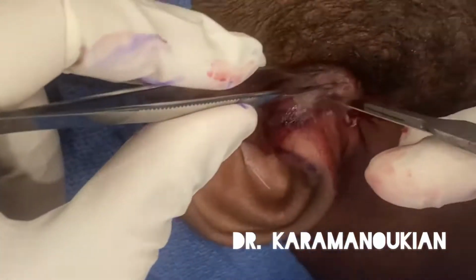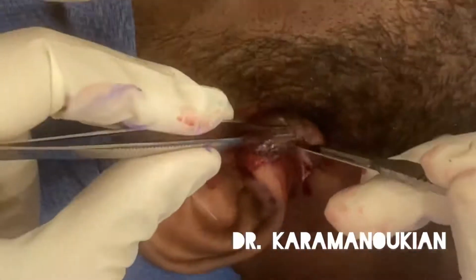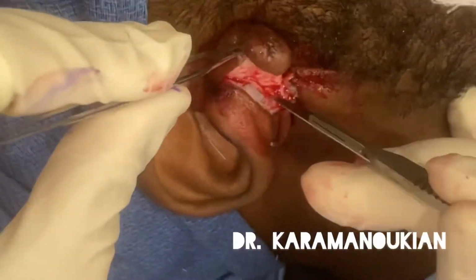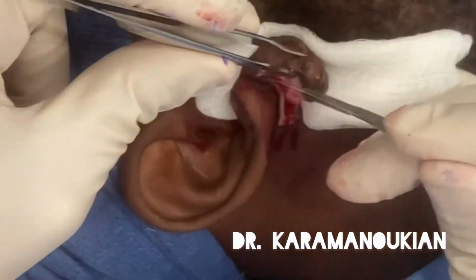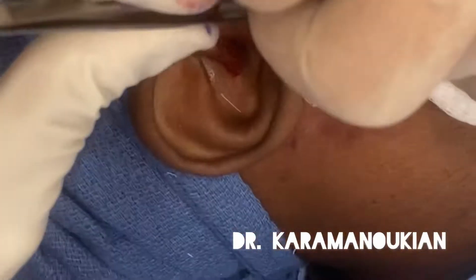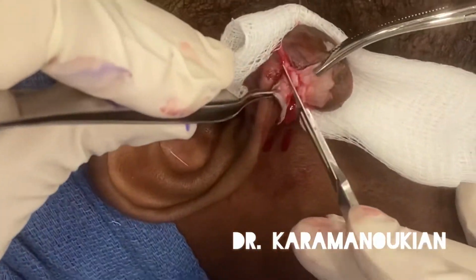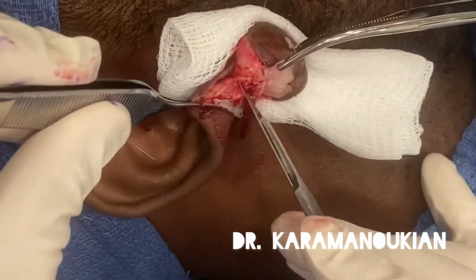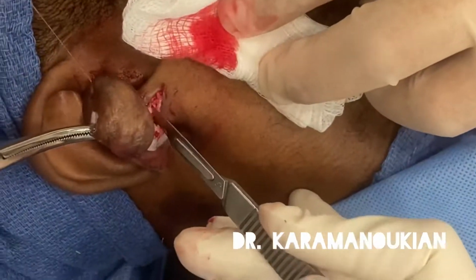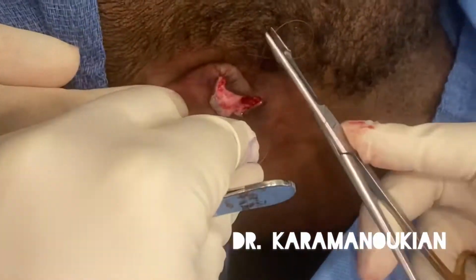People will note that the surgery is not very bloody. I'm using a little bit of numbing medication and the patient is awake. The keloid mass is a large glob of collagen and elastin, and you can see it's white in color because it's not very vascular. And here I'm separating it from the underlying subcutaneous tissue.